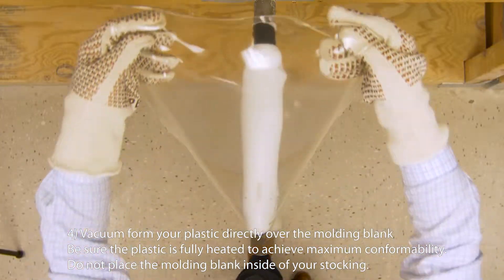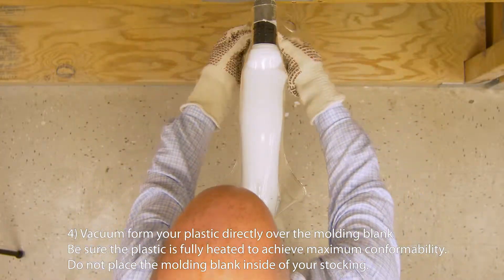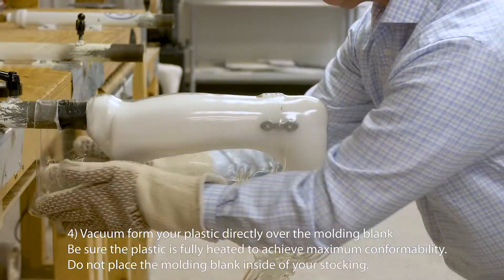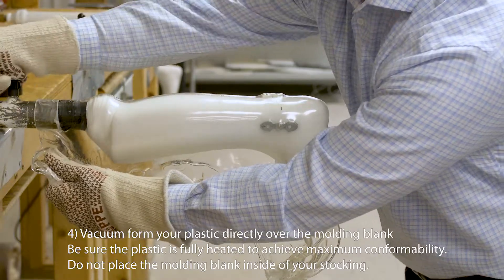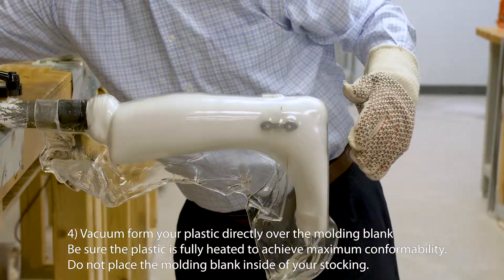Vacuum form your plastic directly over the molding blank. Be sure the plastic is fully heated to achieve maximum conformability. Do not place the molding blank inside of your stocking.